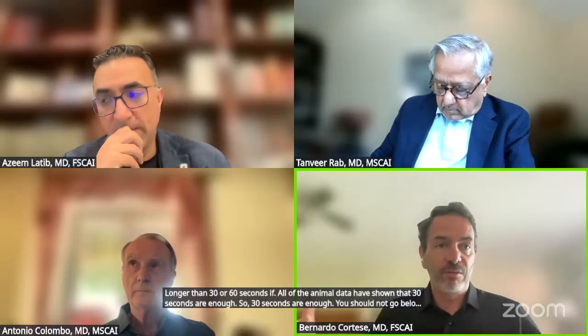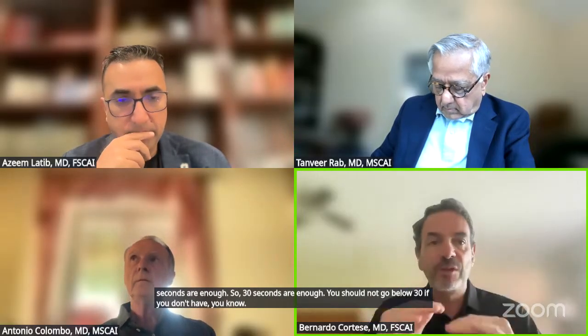And now comes the second question. So why should we inflate the DCB longer than 30 or 60 seconds if all of the animal data have shown that 30 seconds are enough? So 30 seconds are enough. You should not go below 30 if you don't have chest pain, but 30 seconds is a minimum.